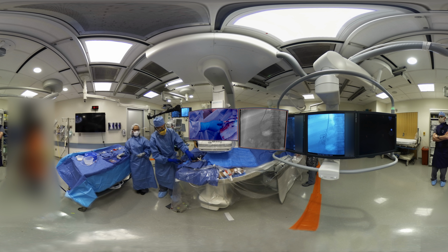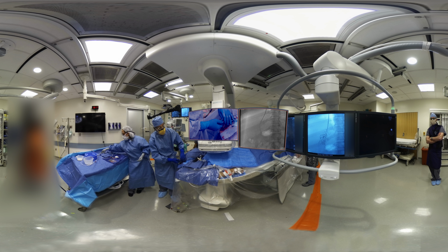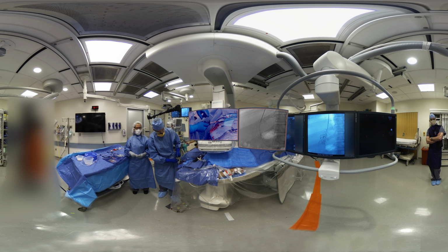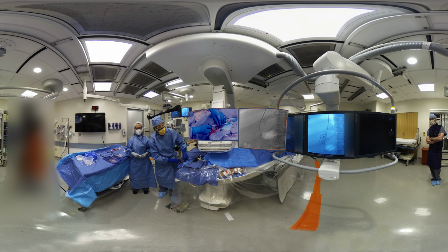And we're going to take some important steps to assure that we won't have difficulty advancing our systems across a fibrotic periportal region, which means I've never let go of the needle. I've never let it turn. I'm going to advance the outer sheath as much as possible. And I'm going to first do that by advancing the needle sheath. And then I'm going to advance the outer sheath, which will have its outer ring. And I'm going to try to get it to the portal vein.